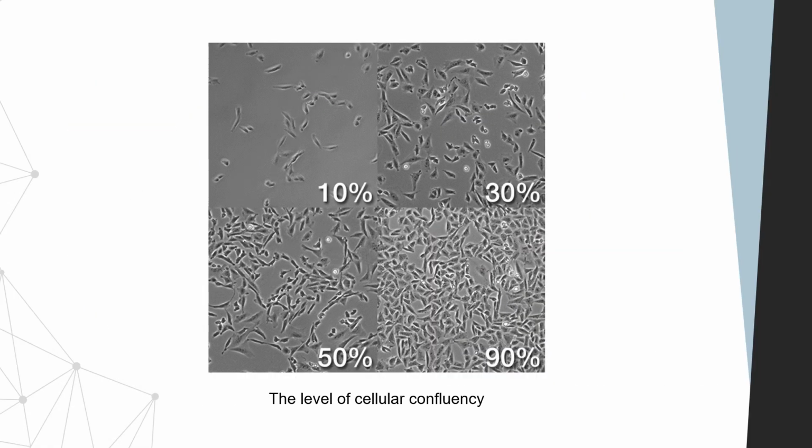The level of cell confluency is really important because the cells are going to change their growth with changing density. So it's really critical. Generally, low density cells at about 10 to 20% confluency will grow slower than cells that are at 50% confluent. And if your flask is completely grown over by cells, almost reaching 100% confluency, then they tend to grow slower again.